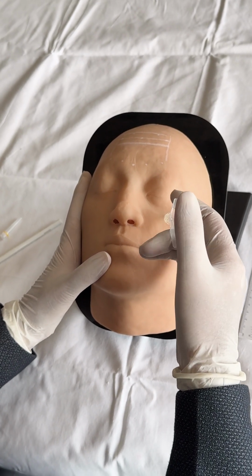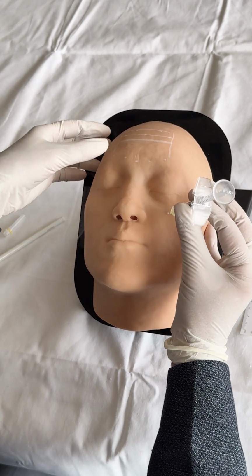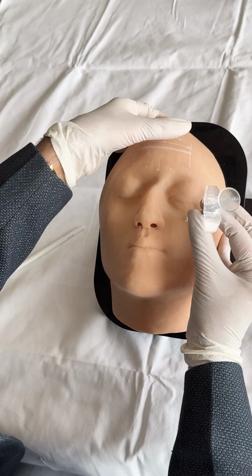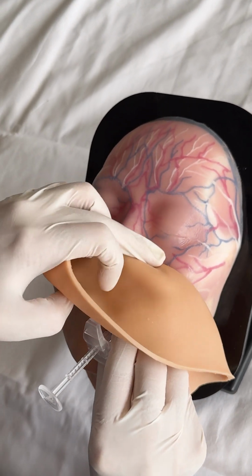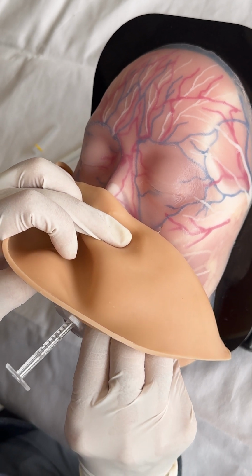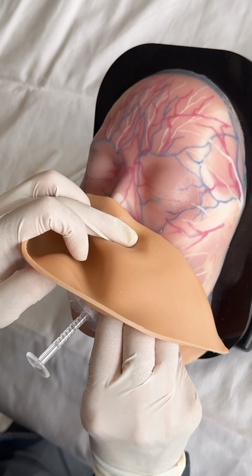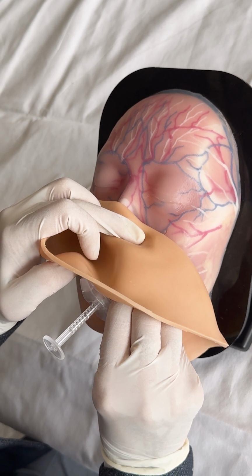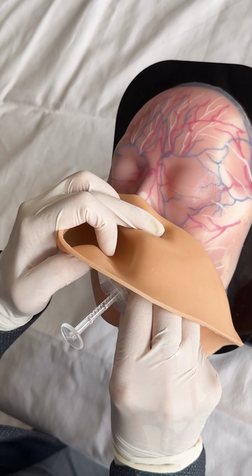Another most important aspect while practicing on FaceSim is to find out whether you have hit an artery accidentally or not. Remove the skin while maintaining the position of your needle intact and visualize on your own. In this case, we are very near to a vein but have avoided penetrating that vein. So this gives the trainer a chance to analyze and give real-time feedback to the trainee that he or she has to retract back and again put in the needle at some other place. In this way, the trainee is correcting the errors in a safe environment.